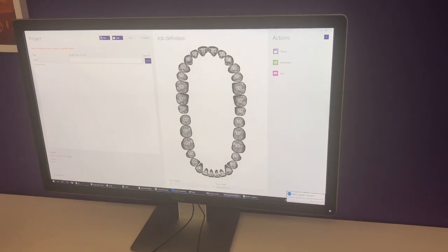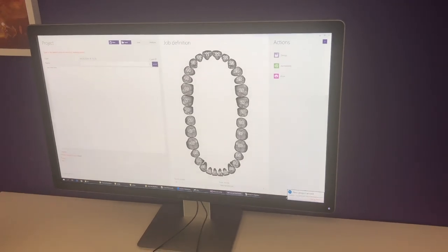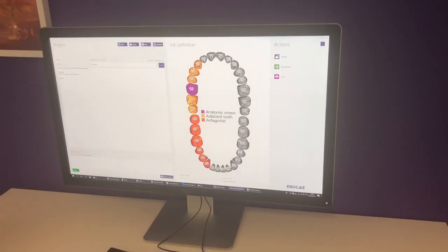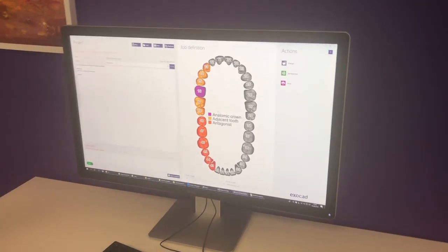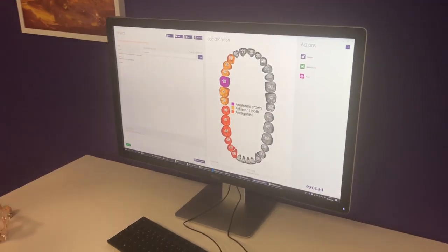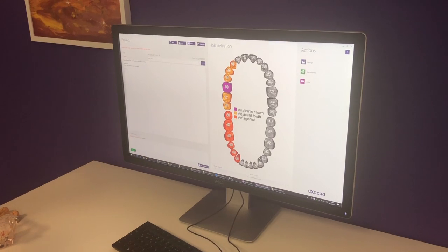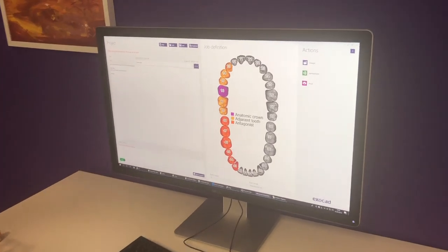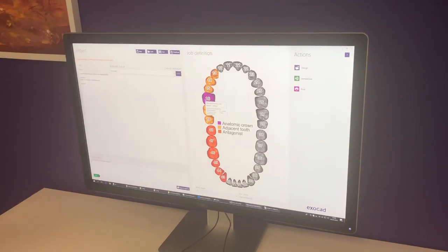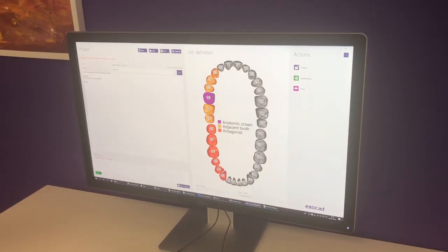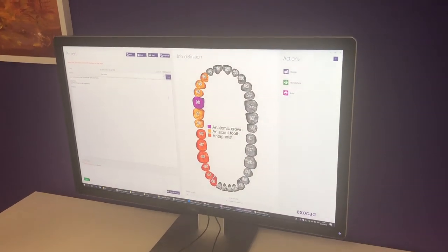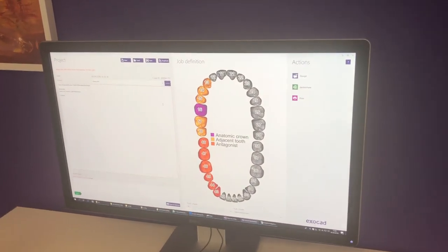I now click on the 'View in DentalDB' button and as you can see the case is automatically imported with the selected material and the selected indication.